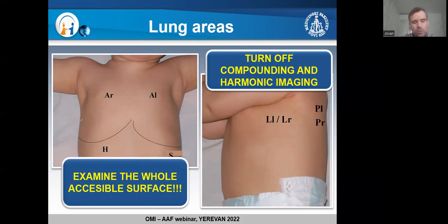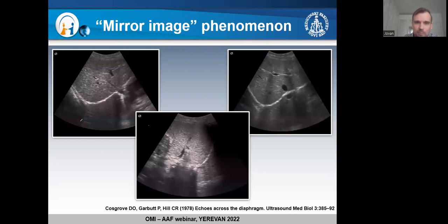And those modern ultrasound devices are trying to take those artifacts from us, and we don't need that kind of help for lung ultrasound. Every examination, I start with the transabdominal, transhepatic, and transsplenic approach. And in the first part of this lecture, we're going to talk about this. You'll see how interesting it is.